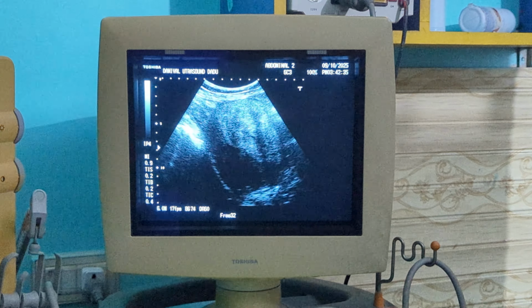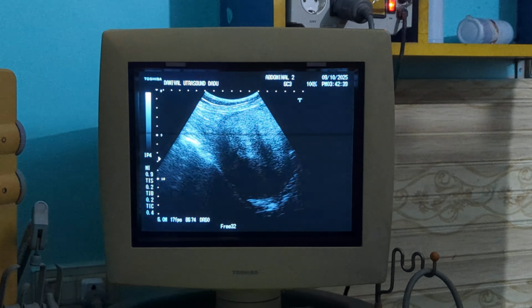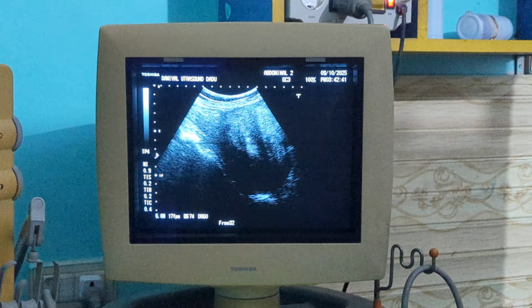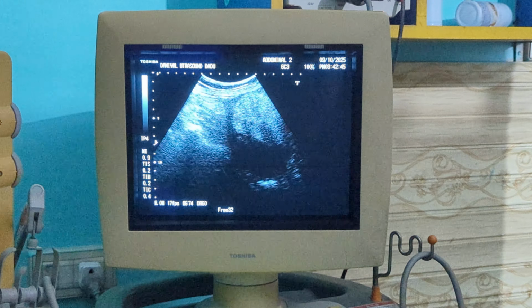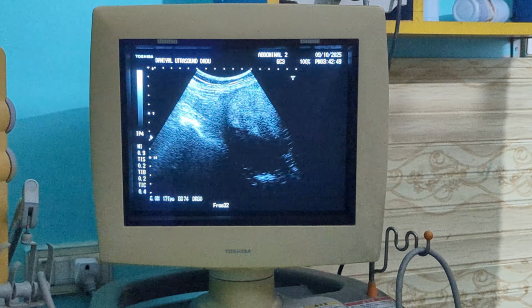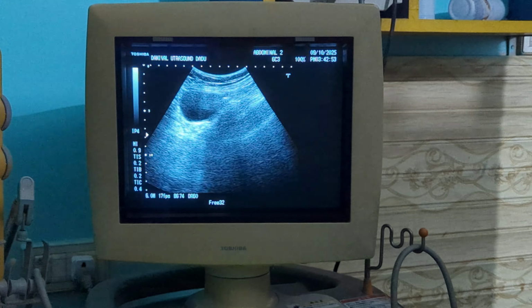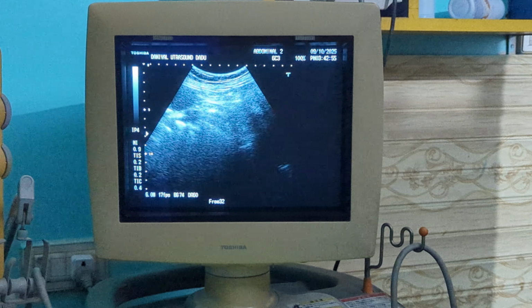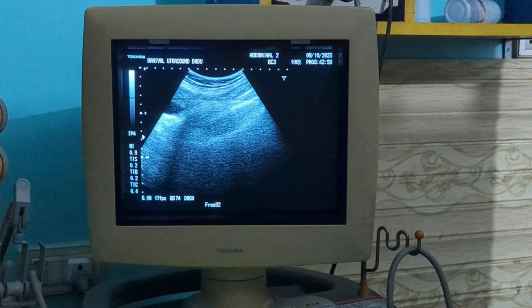The lesion appears solid and contains echogenic foci, casting posterior acoustic shadowings suggestive of calcifications or fatty components. However, the mass appears separate from the uterus to some extent on scanning. And additionally, as I told you, there is a cyst in physiological as well as pathological limits.